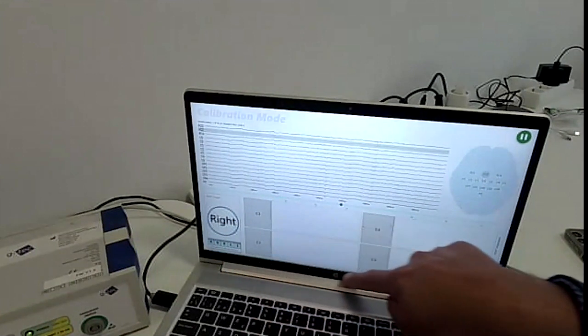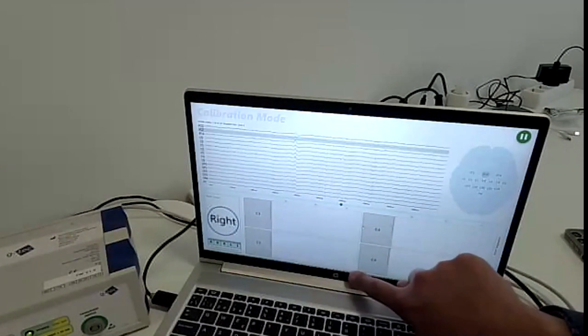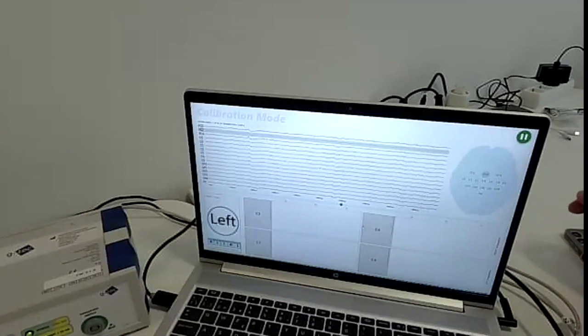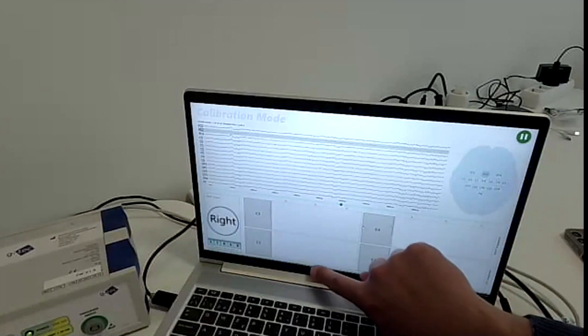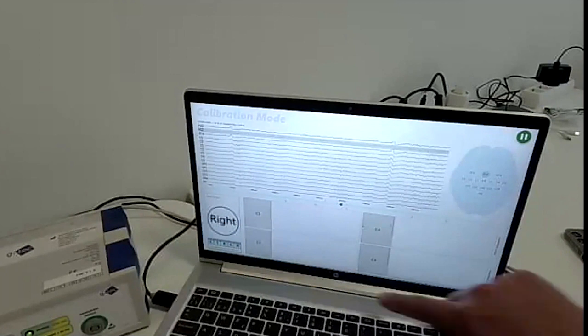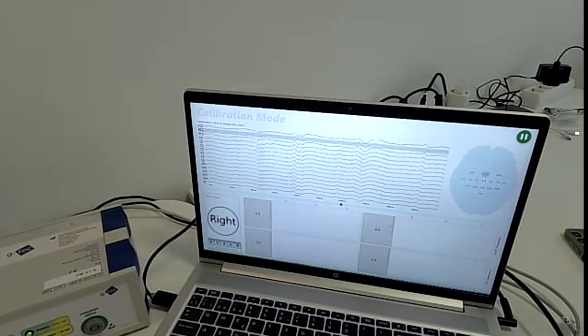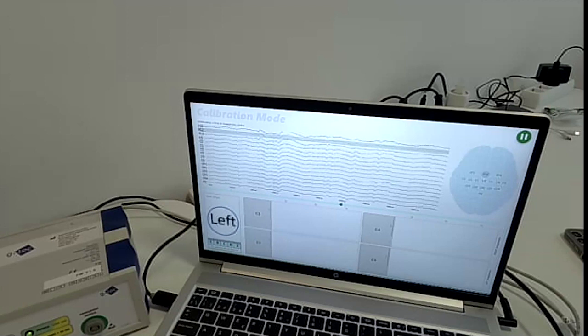In the lower part, we have these small circles. We have 80 circles in total in this lower part of the screen. Each circle represents one motor imagination task, one trial. When a new trial is going on, the circle gets smaller. So you have an idea how many trials the patient did in this run and how many trials are missing. In the middle of the run, when 40 trials are accomplished, the system gives you a chance to do a pause of up to 2 minutes. You can use this pause to motivate the patient, give more instructions, or maybe give him some water if he's getting sleepy. This is how it works.